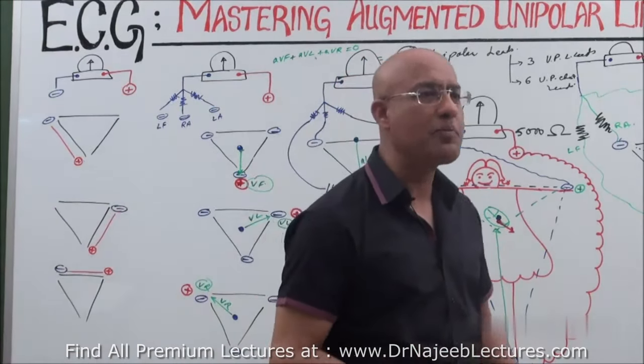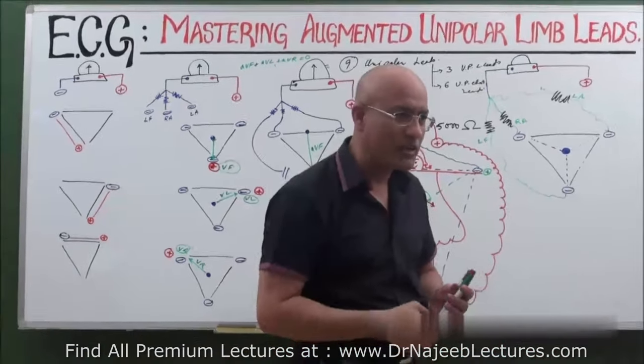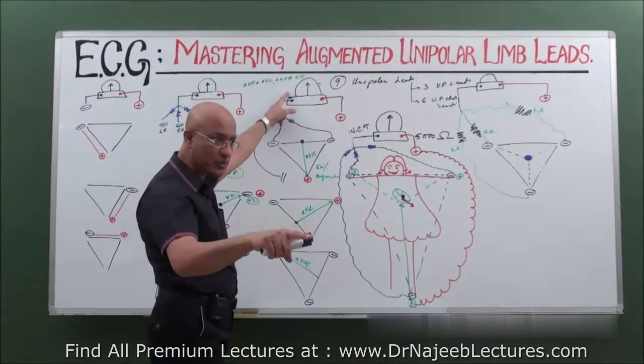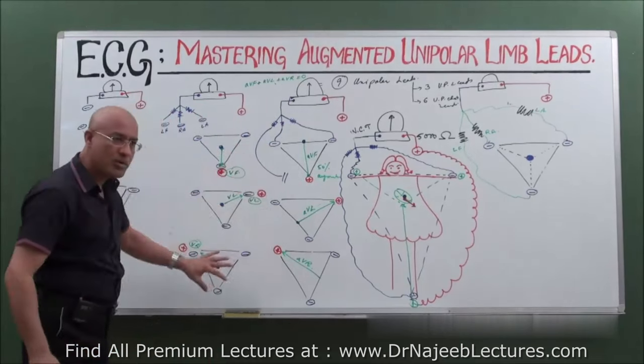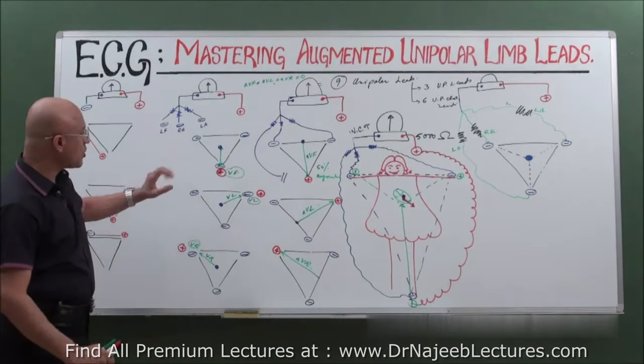And on ECG paper, when you look at the pattern of the ECG and you measure the voltages, you will really see all of them are zero. I will explain in a few minutes. But is it clear now? Yes. Is it clear to you? Yes. Right.